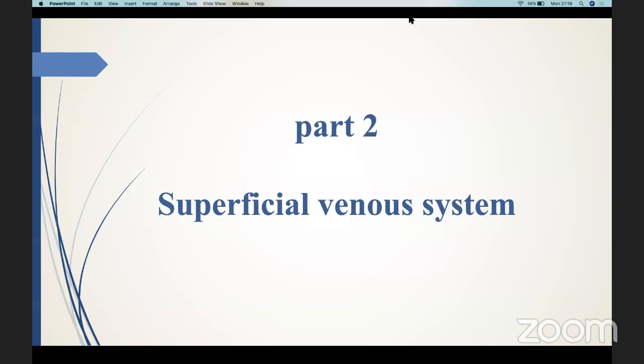Excellent and brilliant question. We've just mentioned May-Thurner syndrome. Ultrasound is 90% unable to detect this syndrome. It's quite high and requires more experience, and you have to link the patient's presentation and history with your findings. So you scan your patient, you find no cellulitis, the varicose vein is still there, and the pain is still there, and you still can't find anything using ultrasound.